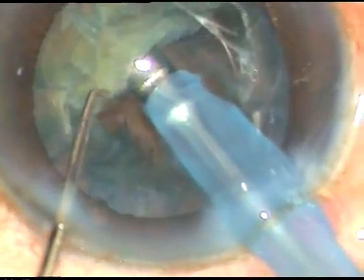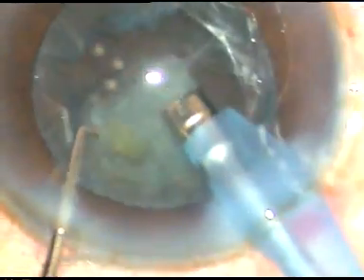The machine being used is the Oertli Cataracts Easy phaco machine. Flow rate is 45 ml per minute, vacuum is 450 mmHg, and ultrasonic energy is just 60% in this grade three cataract.